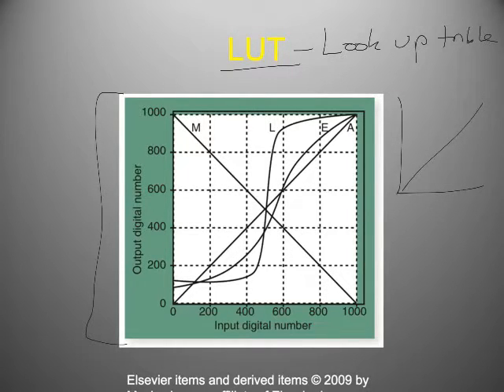So every hand x-ray is going to have the same kind of expectation to it. It's going to have the same kind of histogram shape, right? Every hand x-ray, regardless of if it's overexposed or underexposed, centered correctly or not, collimated correctly or not, will have this signature histogram. The lookup table then takes that and applies it to what you got, and it's going to enhance the contrast.